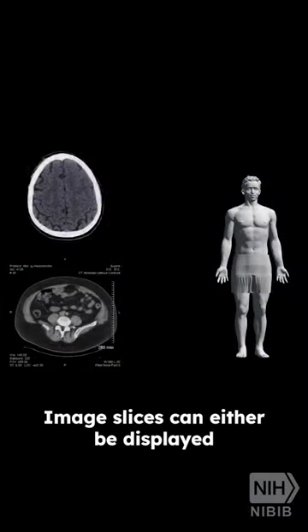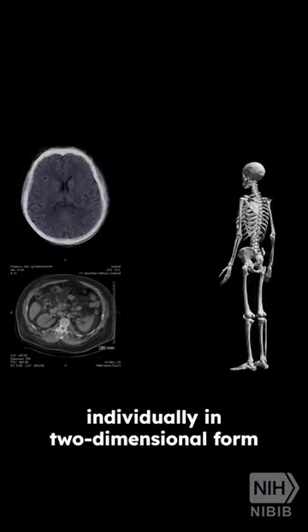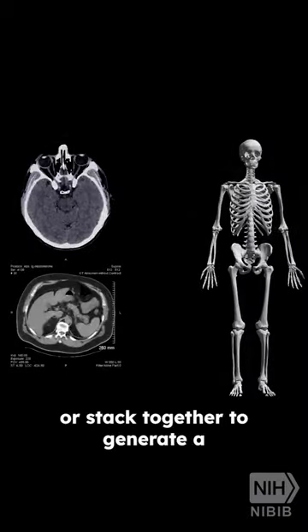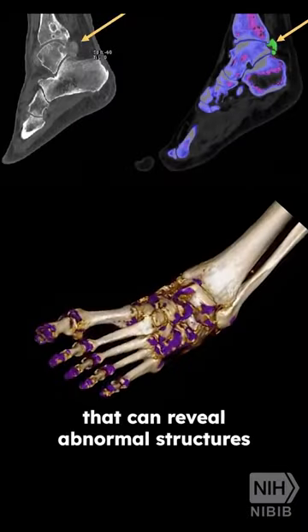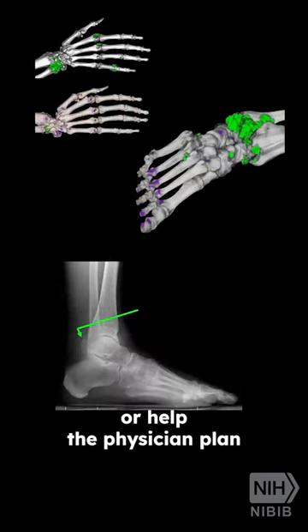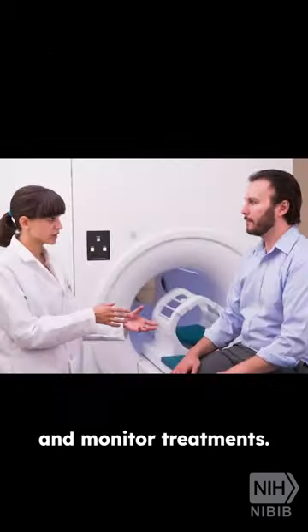Image slices can either be displayed individually in two-dimensional form or stacked together to generate a three-dimensional image that can reveal abnormal structures or help the physician plan and monitor treatments.